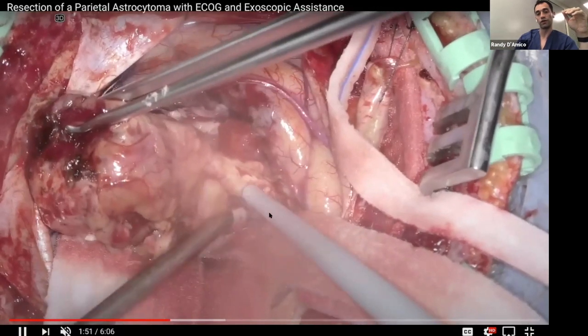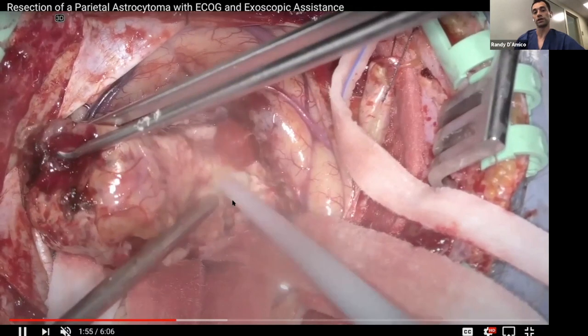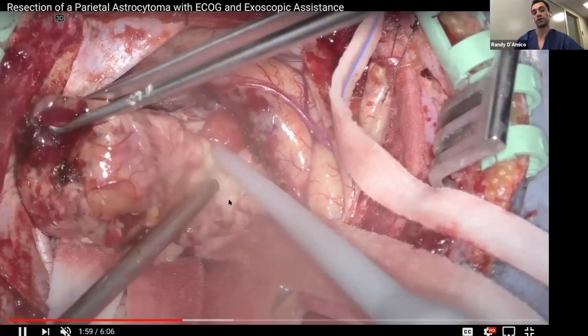Now, this is an instrument. I don't know if you guys have seen this. This is called a Cavitron. This is an ultrasonic aspirator. And so it's actually using ultrasound to disrupt the tissue, and it's got a suction unit on there and it's sucking it up as it goes.